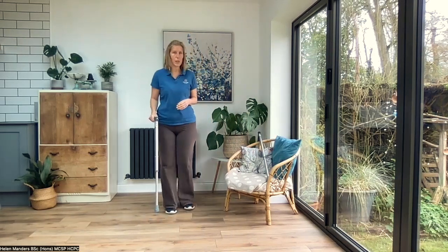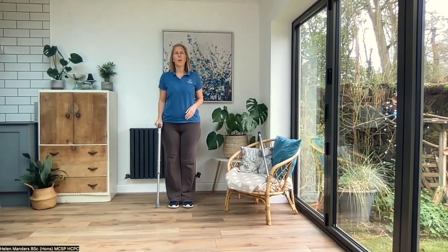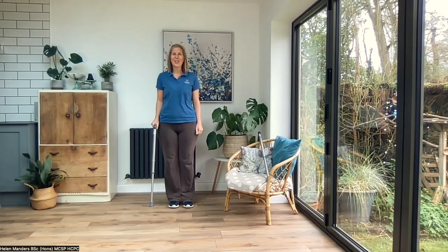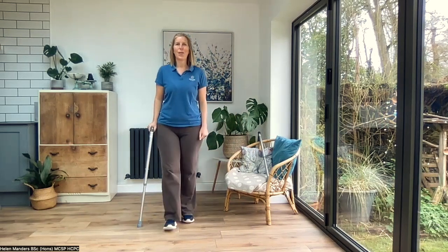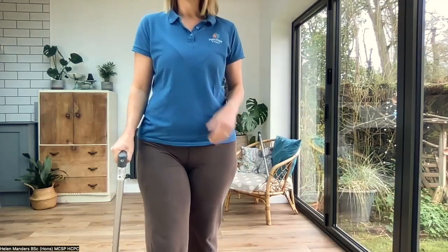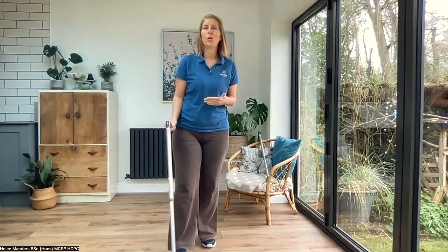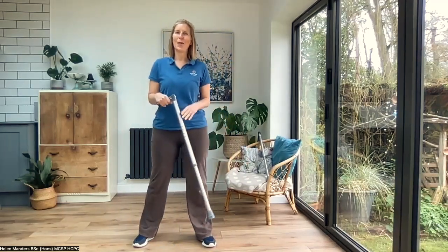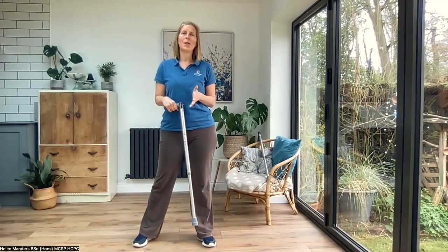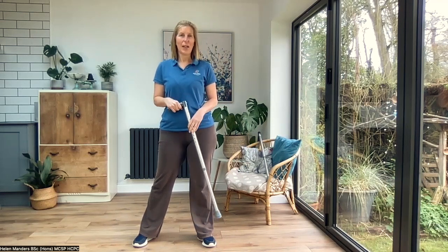So the best way to do this is to pop your stick in the opposite hand. So bad leg, stick in the opposite hand, and you're just going to step forwards. Good. Similar to what we did in that last reciprocal walking pattern, but just with the one stick. So there's a few options there for you to move through as you feel able to.